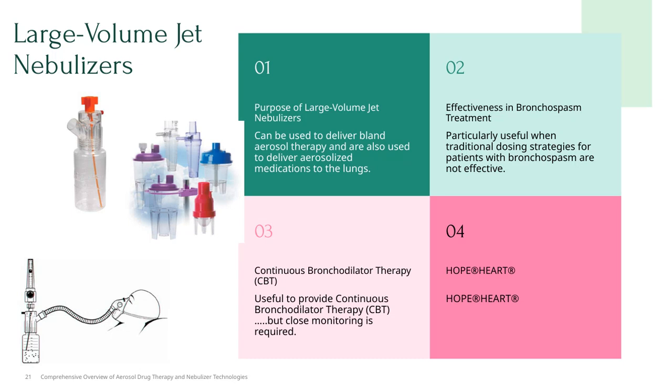Today, I'll be discussing the purpose of large-volume jet nebulizers. These devices are versatile because they can deliver bland aerosol therapy, which is helpful for humidification and other non-medicated treatments. But they're also commonly used to deliver aerosolized medications directly to the lungs, making them a key tool in respiratory therapy. One important application is continuous bronchodilator therapy, or CBT.